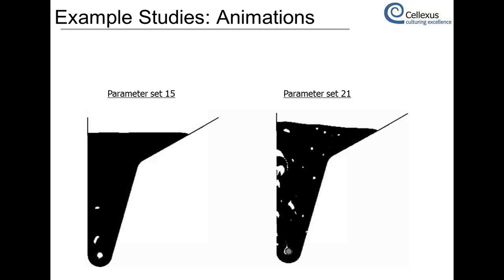Now the question is, if you're going to optimize a bioreactor, where do you optimize the bubble sizes to? What sort of equivalent circular diameter and aspect ratio are you looking for? So we looked at some publications by Christie and Godet et al., who looked at sparge bioreactors, and they found that most of the damage done to cells was done on the surface. So what they found in their studies is that they need bubbles of diameter greater than 7 millimeters but less than 20 millimeters to prevent cell death, with an ideal target of around 10 millimeters.